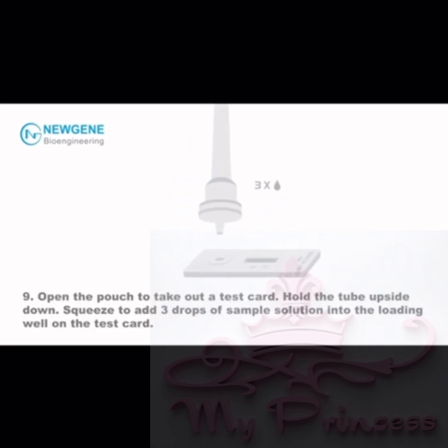Step 9: Open the pouch to take out a test card. Hold the tube upside down and squeeze to add 3 drops of sample solution into the loading well on the test card.